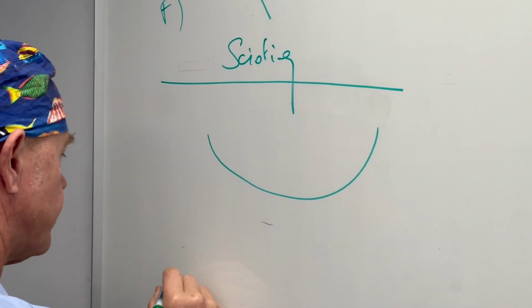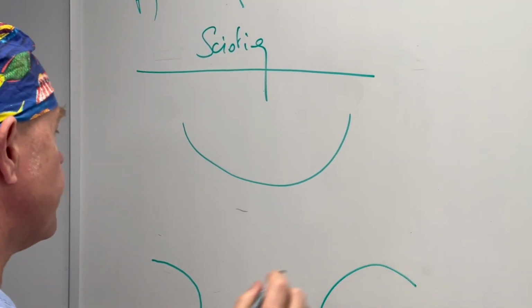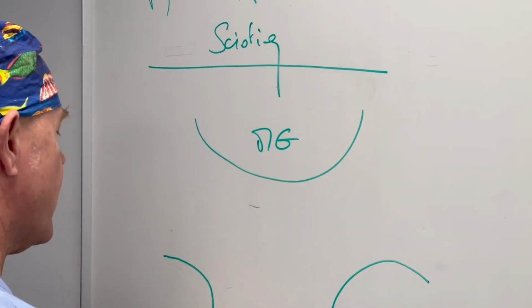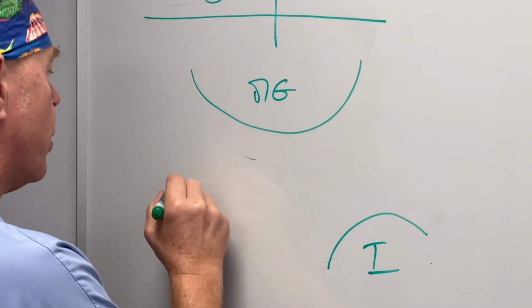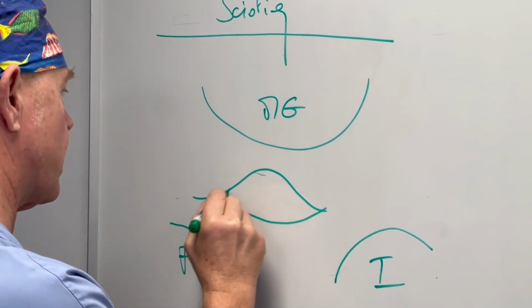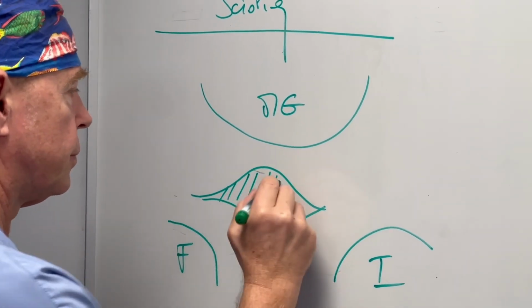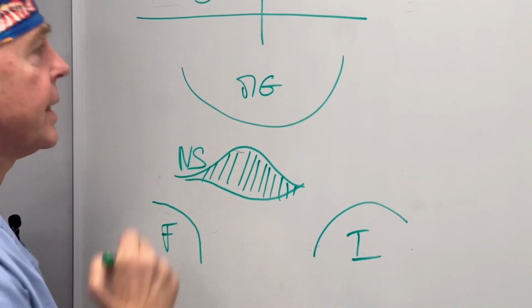Is that correct? Thus, this encompasses the gluteal region, the femur bone, the ischium, and at this specific subgluteal level, the sciatic nerve frequently exhibits this particular type of appearance. Here we possess the sciatic nerves.